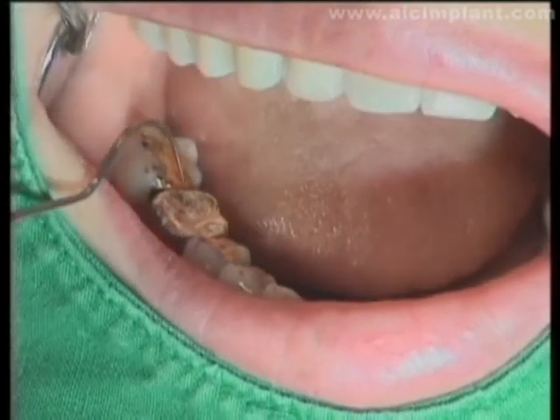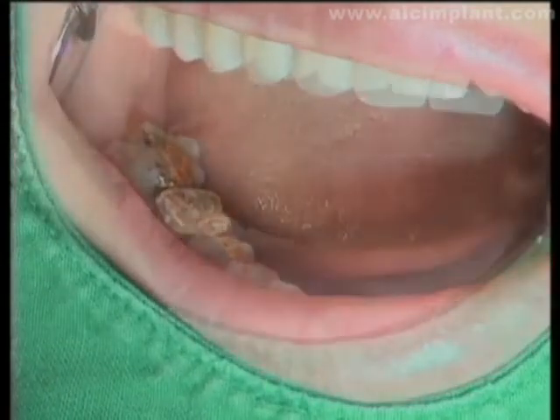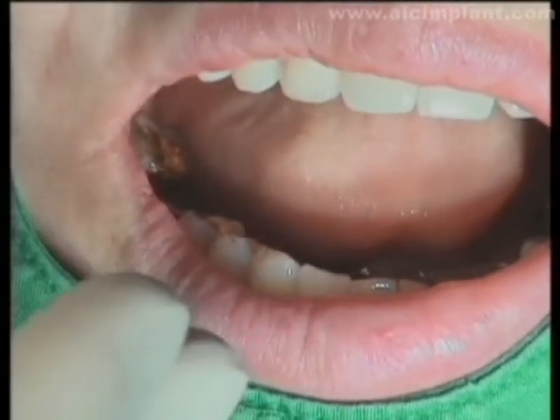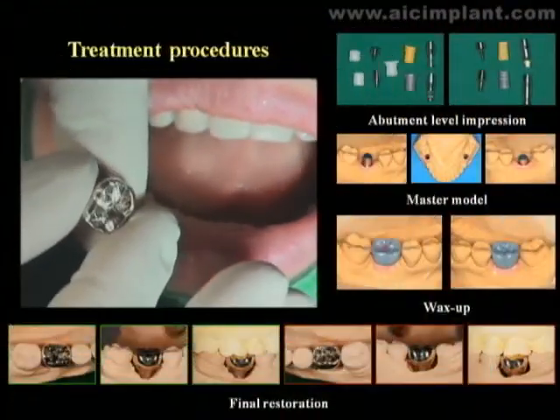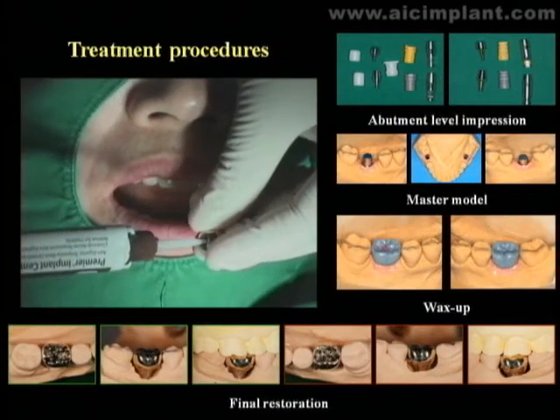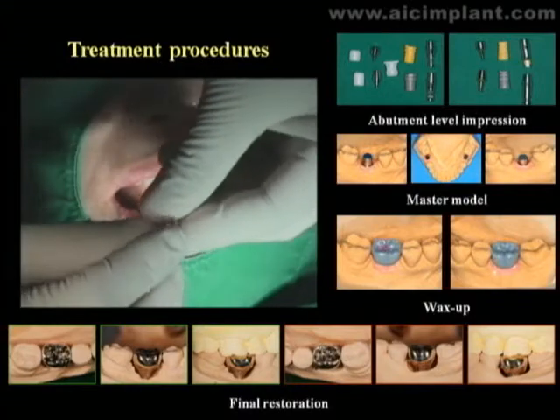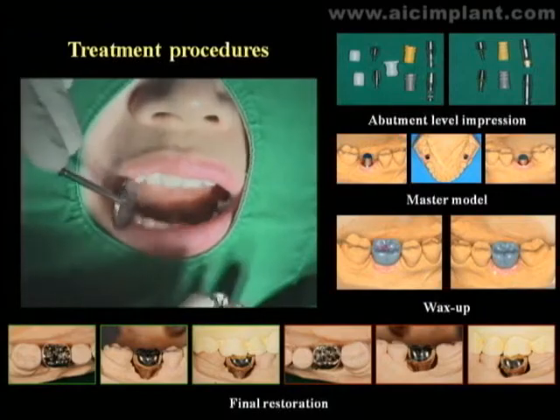Adjusting the occlusion is very important to give a relatively weak bite on the implant, even when it is not infraocclusion. Once the occlusal adjustment is finished, the prosthesis is high polished and prepared for setting. In applying cement, I do not apply it on the entire margin. Instead, I limit the application to the occlusal surface to minimize the danger of residual cement.